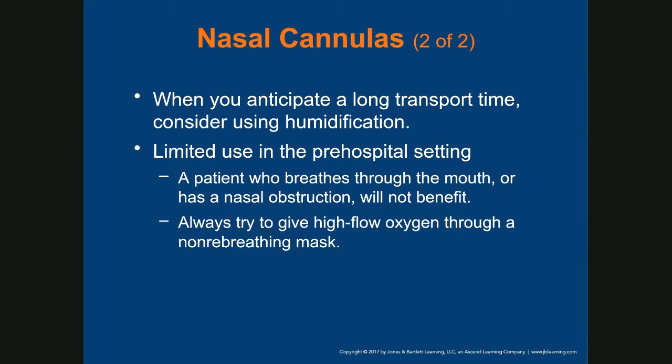Now, limited use in pre-hospital setting. What does that mean? It means when we come off our unit and go to the patient and assess the patient, and we're providing oxygen therapy, we do not use the humidifier at that point, because if we have the humidifier on the cylinder at that point, it has to stay upright.